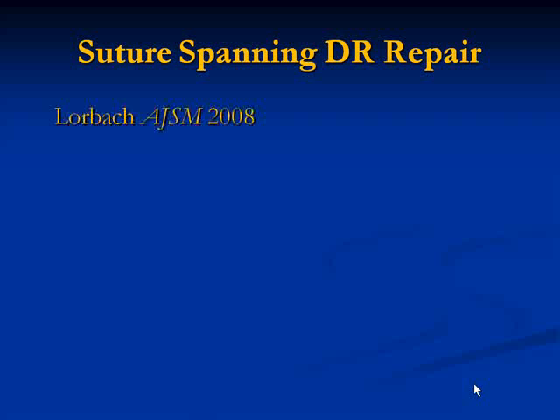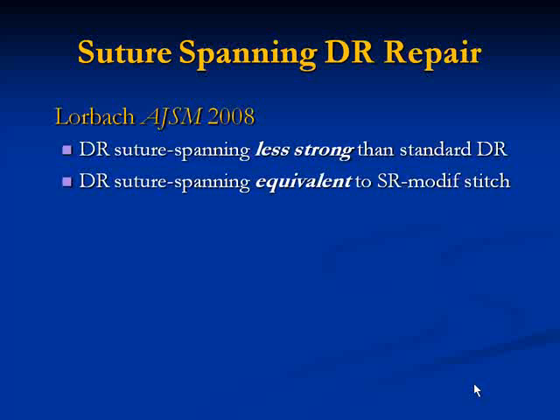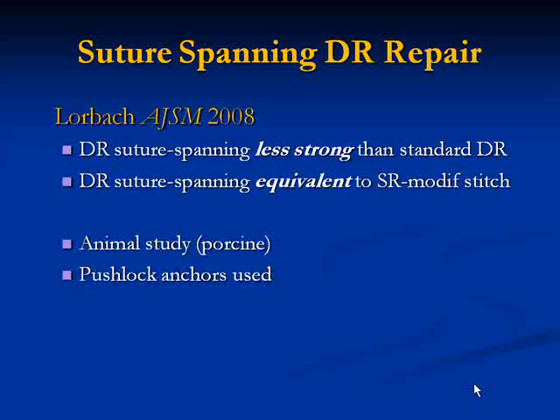Lorbach, again in 2008, though, did a study, and they showed that the suture spanning was less strong than a standard double row technique, and was equivalent to a modified single row technique that used a modified stitch similar to an arthroscopic Mason Allen. This was an animal study. However, push-lock anchors were used, which tend to have a lower pull-out threshold than some of the other knotless anchors. So these may be some issues with that.